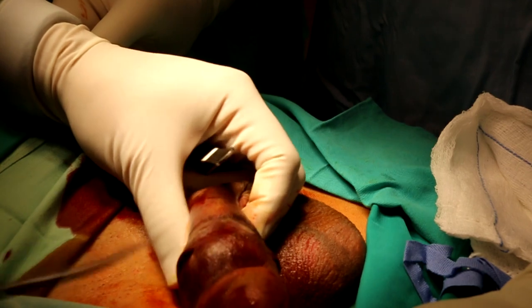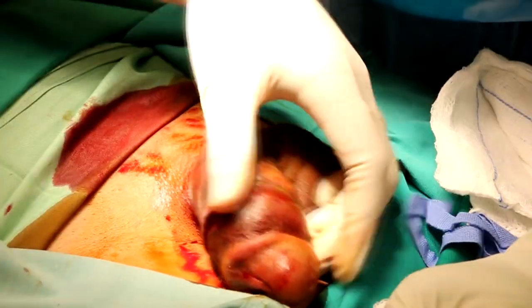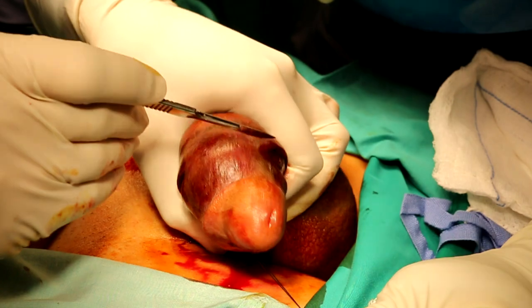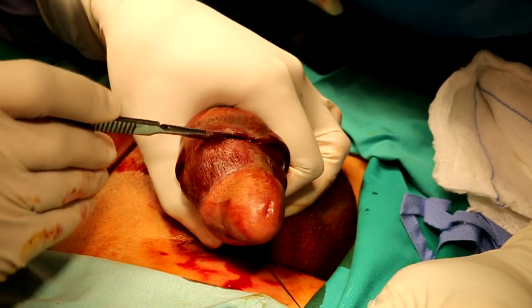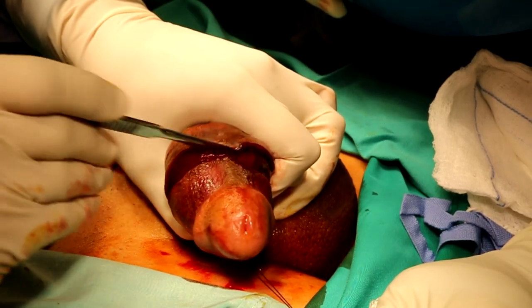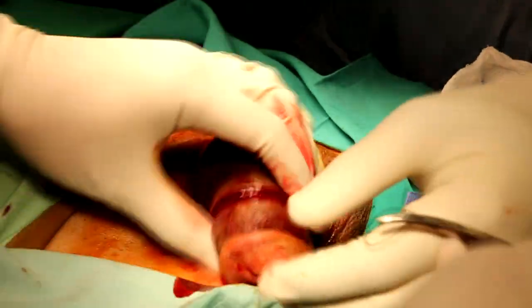You see now I'm dissecting down, but because there is a hematoma and a swelling, you see I'm away now from the urethra. I switched from the scissor to the scalpel. From end to end, it is a straight line, and it is easier with a scalpel. Okay, so now we are done with the circumferential incision.